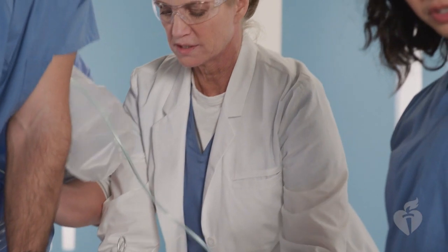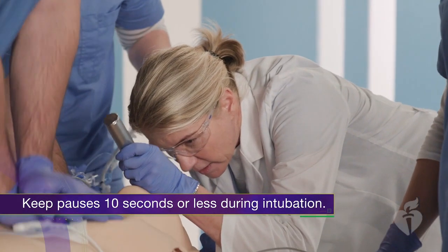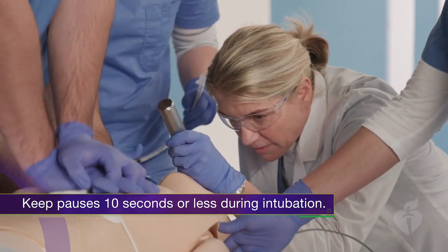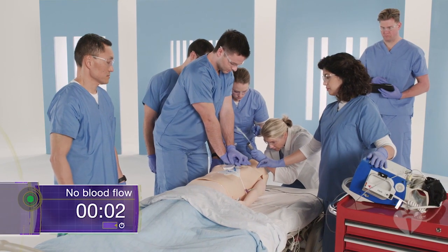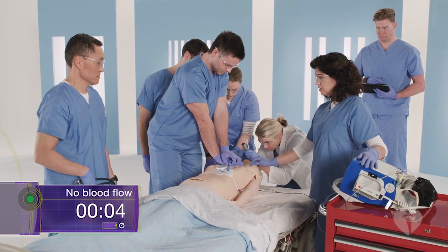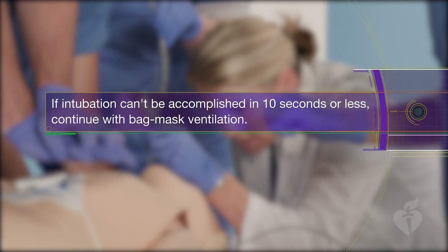"Okay, through the cords." But if it's necessary to pause for intubation, the pause must be for 10 seconds or less. "I'm still having trouble." "Go ahead and pause CPR." "Okay, there we go. Through the cords. Continue." If intubation can't be accomplished in 10 seconds or less, the team should continue compressions with bag mask ventilation.